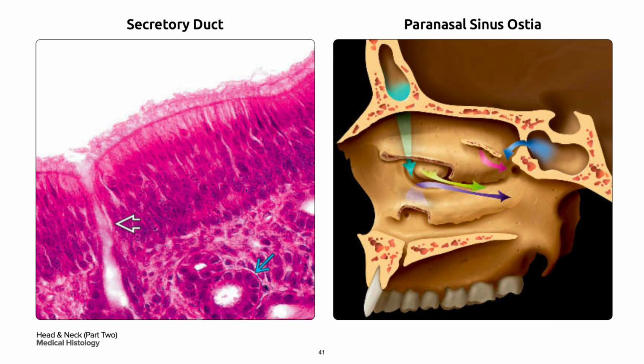On your left are olfactory glands in a single blue arrow that drain secretions directly to the surface via the short ducts in bold white arrow. These secretions are thought to trap and dissolve odoriferous substances, allowing new substances to be recognized.